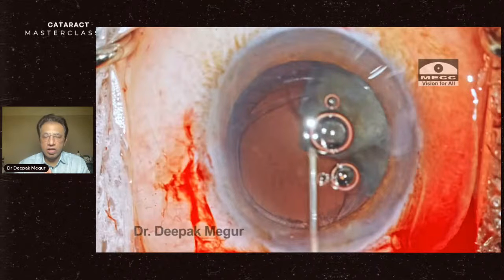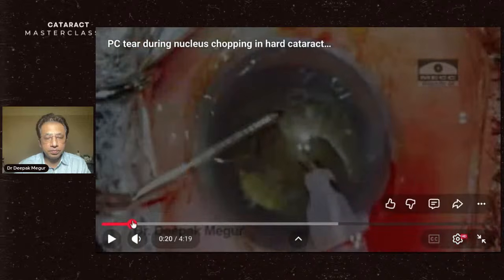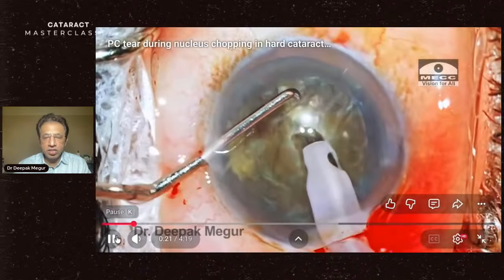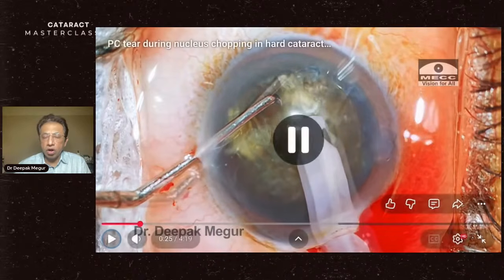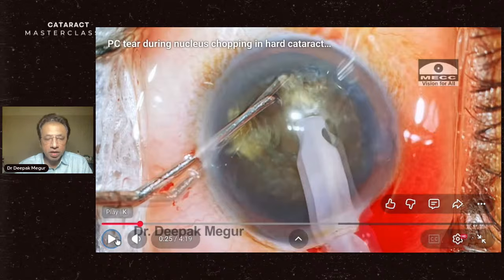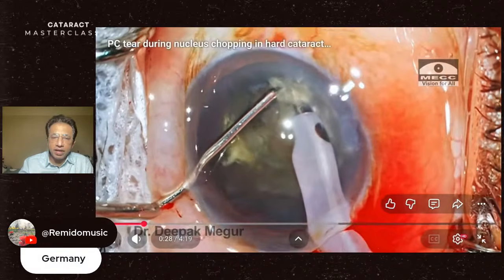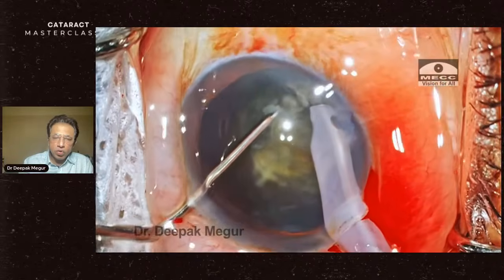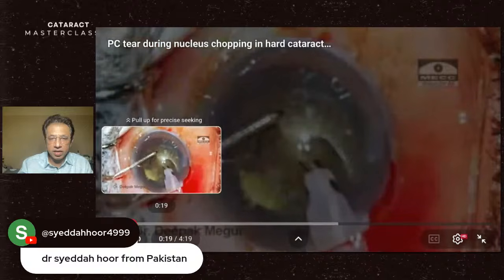Although the surgeon was quite delicate, still, the first torque itself, let me go back and show you here. The first torque, when you go in, this can happen because of two things. You have not got a good grip, or the chopper, ideally you should use a much sharper chopper. Your burying has to be sufficiently posterior. If you don't have that and you lose the grip, this is when you're going to get a torque. Let me just play that first scene here.